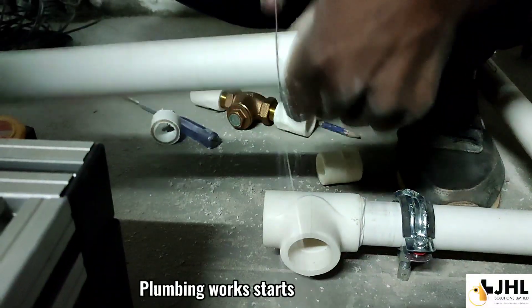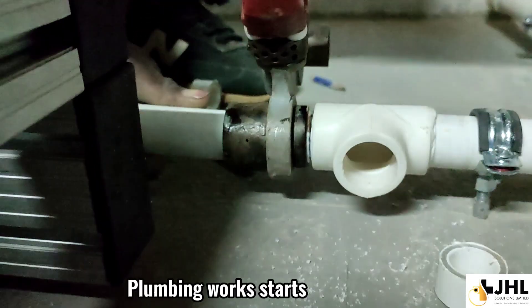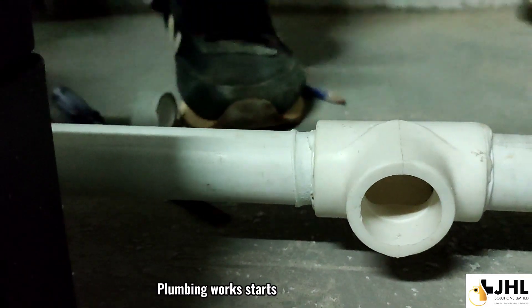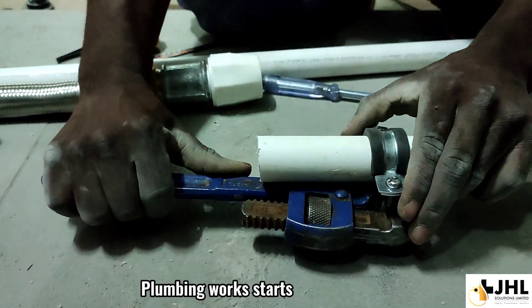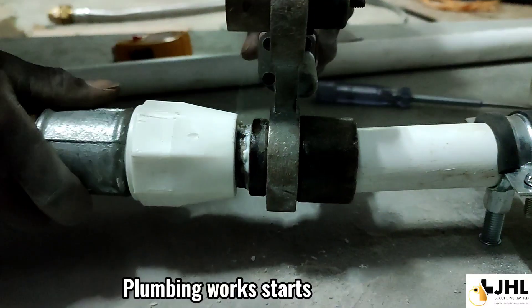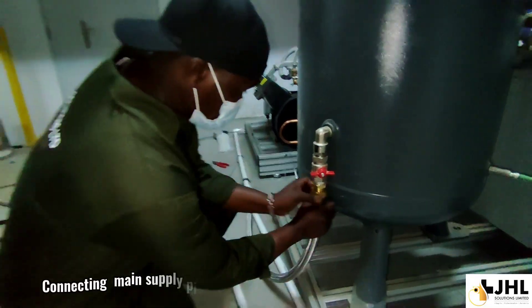Plumbing work starts. Connecting main supply pipe.